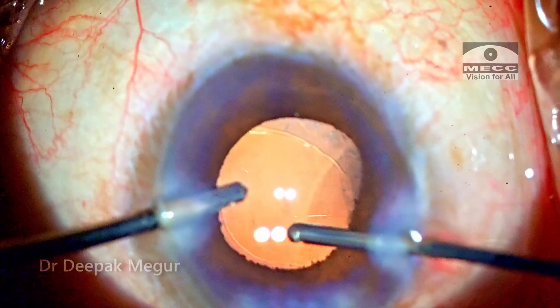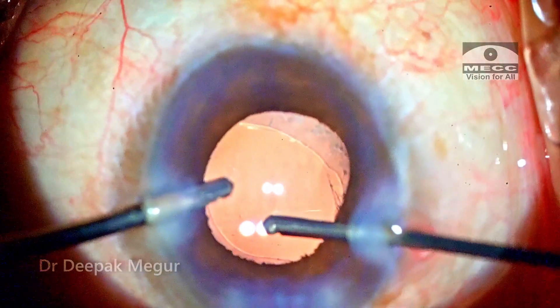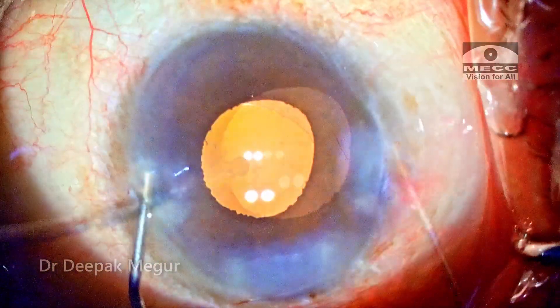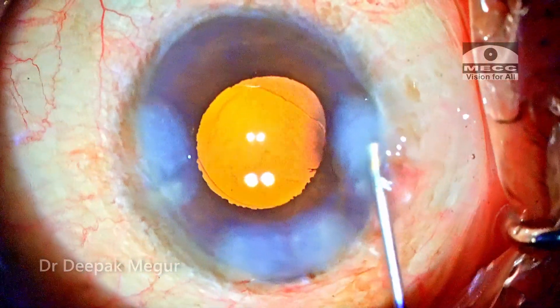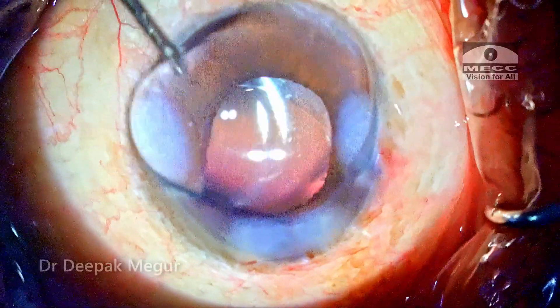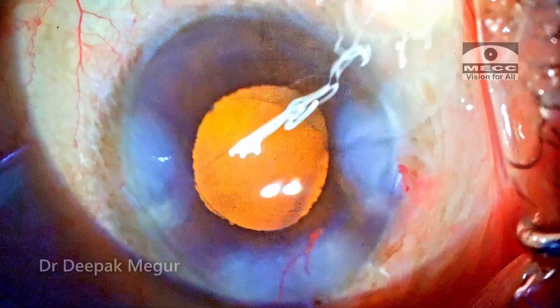Intracameral pilocarpine is used to constrict the pupil so I don't miss any vitreous strand. The side ports and the main incision are hydrated. Intracameral antibiotics are placed and the case is done. This case was done entirely on topical anesthesia — the patient was extremely cooperative.